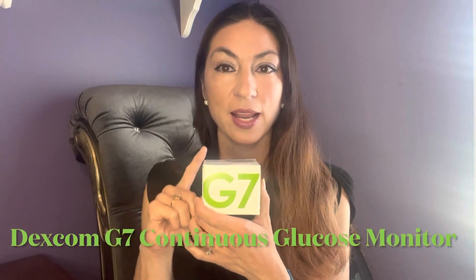Hi guys and welcome back. Today we're going to be talking about the Dexcom G7. I absolutely love this device. It is the new continuous glucose meter by Dexcom. We'll be going through the differences between the G7 and the G6, and I'm going to do a demonstration on myself on exactly how to insert the sensors.